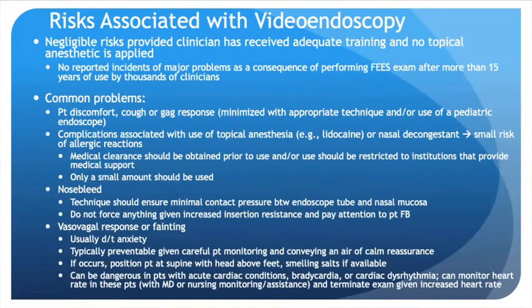So risks associated with video endoscopy: there are negligible risks for FEES, provided that the clinician has received adequate training and that no topical anesthetic has been applied. There have been no reported incidents of major problems as a consequence of performing a FEES exam after more than 15 years of use by thousands of clinicians.